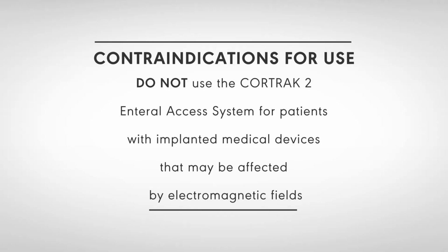Contraindications for use. Do not use the CORTRAK 2 enteral access system for patients with implanted medical devices that may be affected by electromagnetic fields.